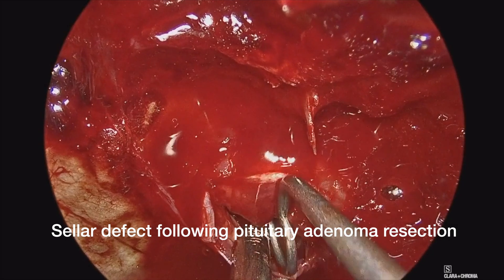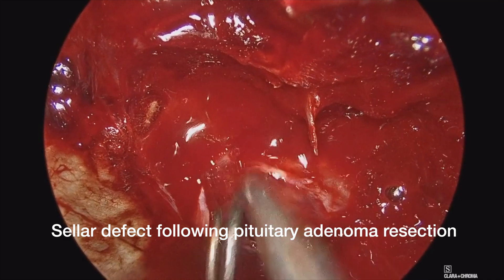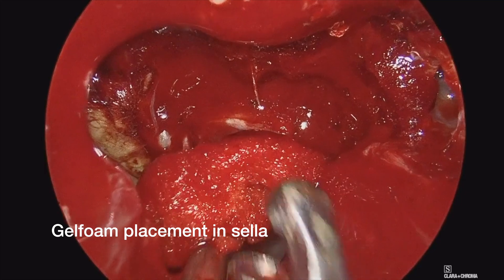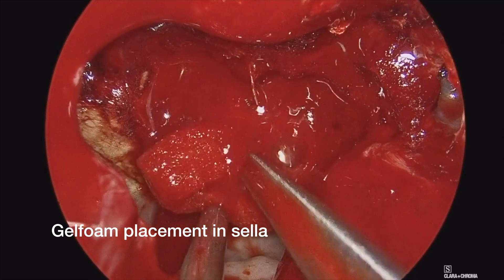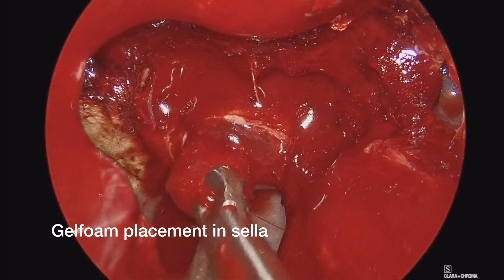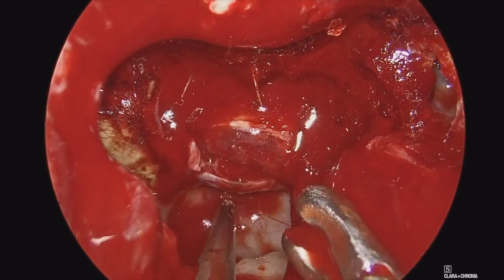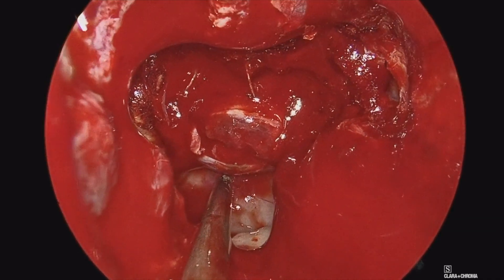At the beginning of the video here, you can see the tail end of the pituitary tumor resection, examining the sellar defect with the normal gland just there. There was a mild to moderate weepage of CSF through the diaphragm. Here we are putting a piece of gel foam in through the dural defect into the area where the pituitary tumor was resected from.